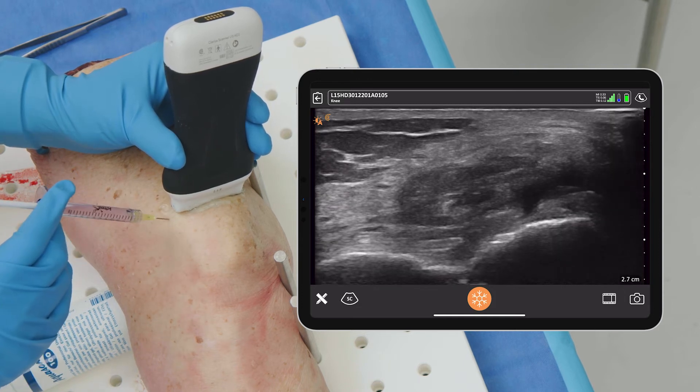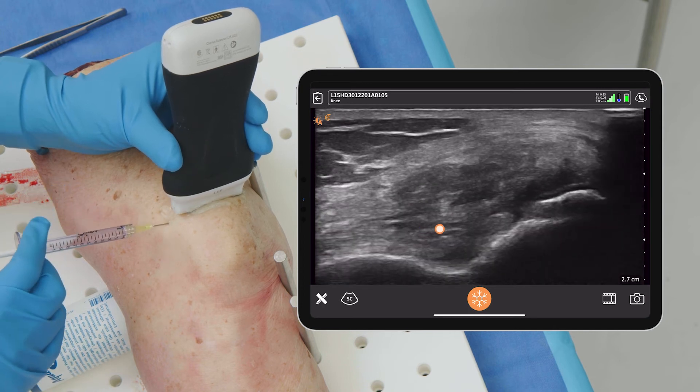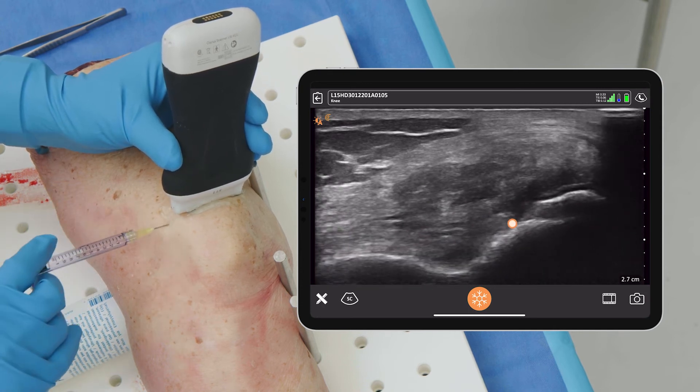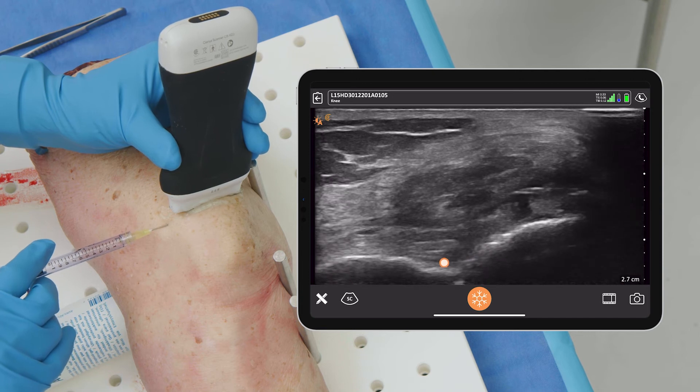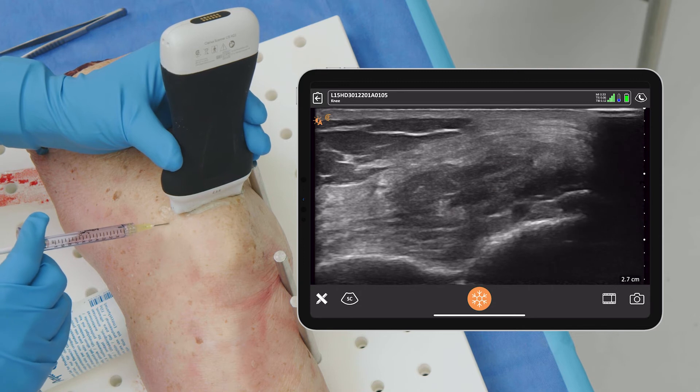You can see that if I were to come down lower, that would put me right into where the fat is. If I came more proximally up here, I'd be into the tendon — I don't want to be there. So into the joint right there is the ideal spot.